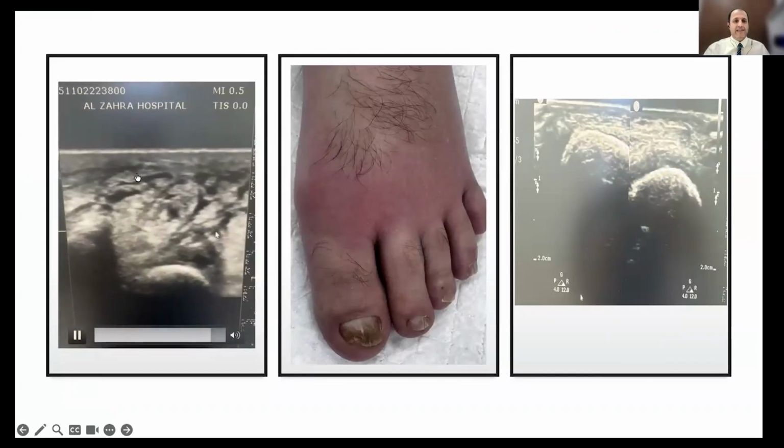You can see here there is fluid accumulation, a cobblestone pattern, which we always talk about with cellulitis. This comes to our mind. And I searched and assessed the case more, and found something unexpected. Here, this one is the normal side, and this one is the abnormal side. There is a small effusion around MTP1, so it looks like maybe arthritis. The patient doesn't have pain because he was on tramadol and antibiotics, so it came with an atypical presentation. So we aspirated, and the diagnosis looks like arthritis.